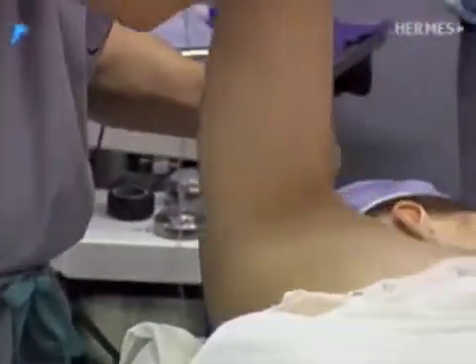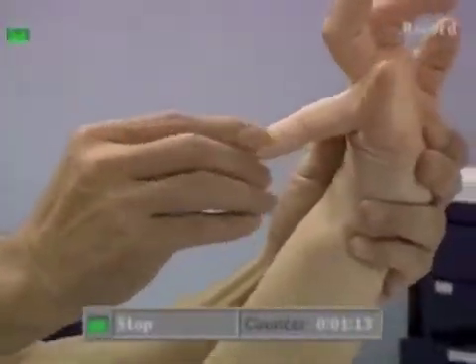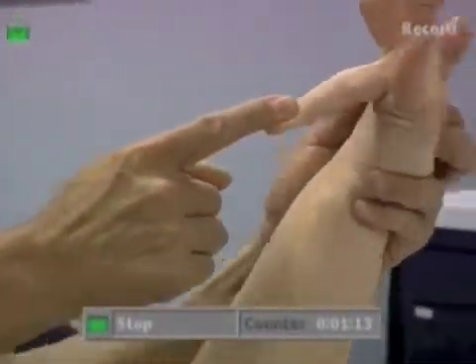This is a right shoulder in a 17-year-old female with symptomatic multidirectional instability and Ehlers-Danlos syndrome. Her laxity in all three directions is clearly evident on the evaluation under anesthesia, as are other signs of hyperlaxity.